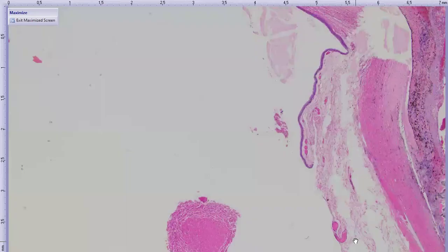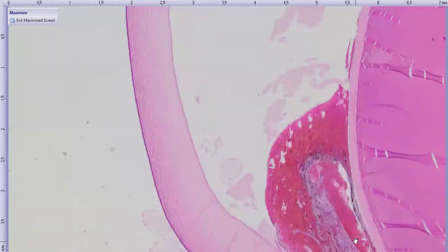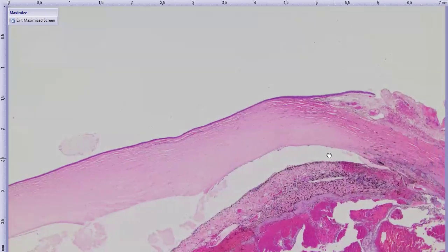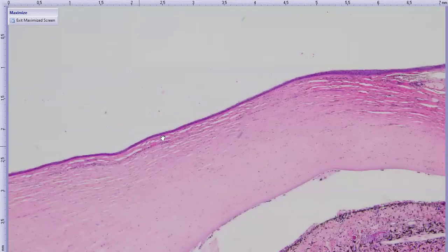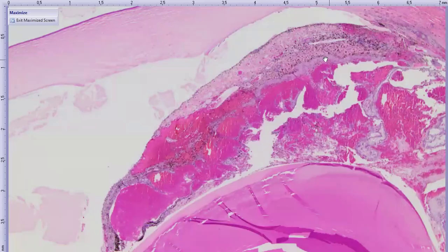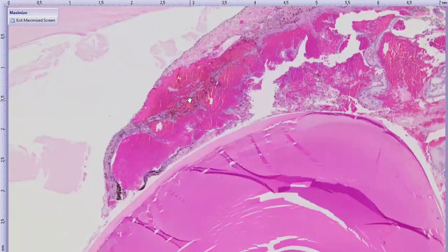Moving from front to back, the front is not so exciting compared to what is happening in the back. So let's see here. There's a very mild peripheral corneal stromal vascularization, which happens whenever the eye is ticked off or when there's a corneal ulcer. So here we have the iris. As I said, there's this membrane that also entraps some of the iridociliary epithelium, causing posterior synechia. There's some iris stromal hemorrhage as well.